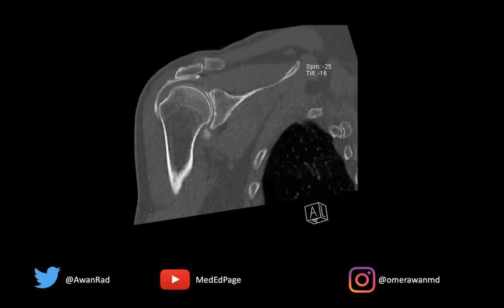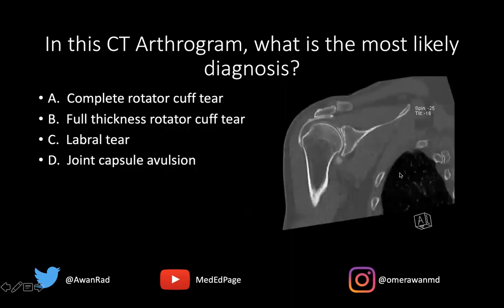Hello everyone, and welcome to MSK Unknown Case Series, case number 77. Here we have a CT arthrogram image of the shoulder. This is a CT arthrogram, and the question is: what's the most likely diagnosis?